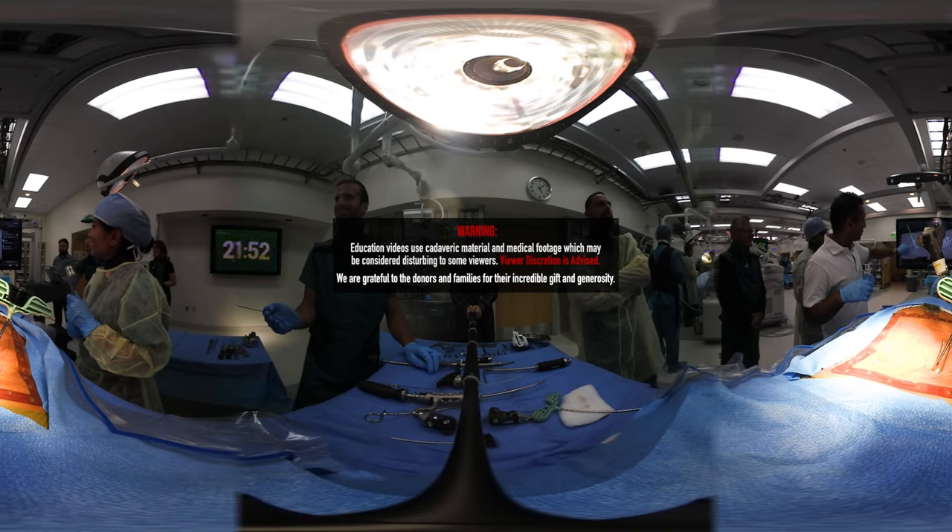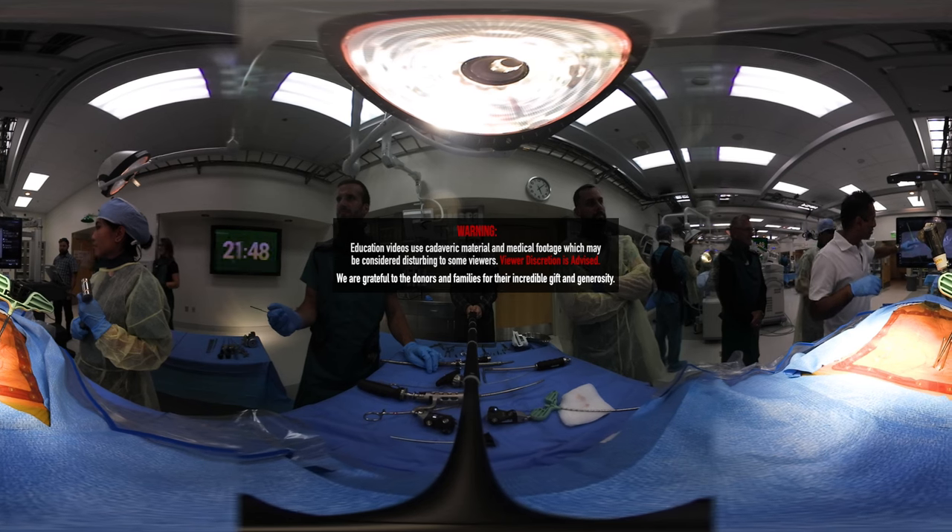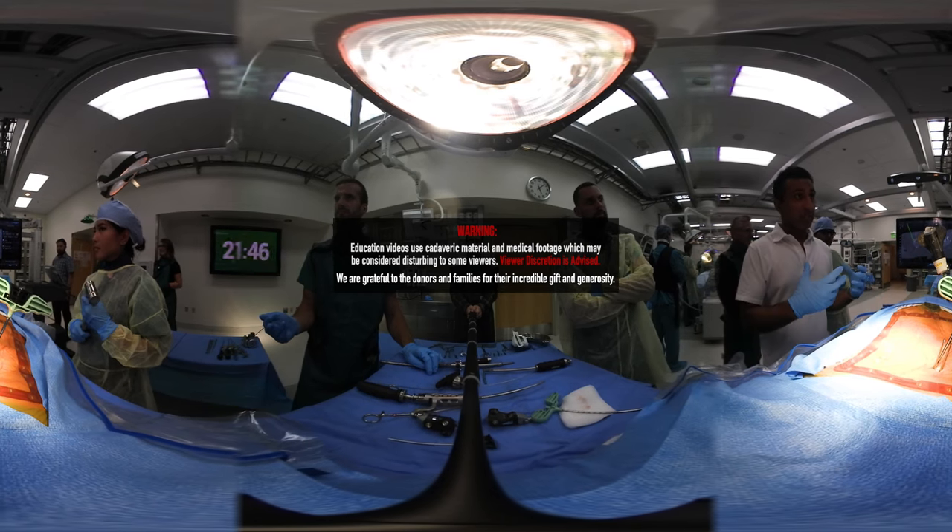So now you are in the vertebral body — in the vertebral body. You're in the vertebral body on both views, and you're really in the vertebral body.